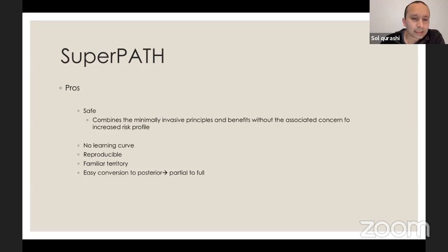And so you learn at your own pace. And it's not implant specific. There's a whole variety of implants that are available, but if you wanted to do something else, I'm sure it can be doable. And the instrumentation as well is nothing special. You don't have a complex traction table or this and that. They're just basically Hohmanns that have got certain angles and there's a cannula, that's it.